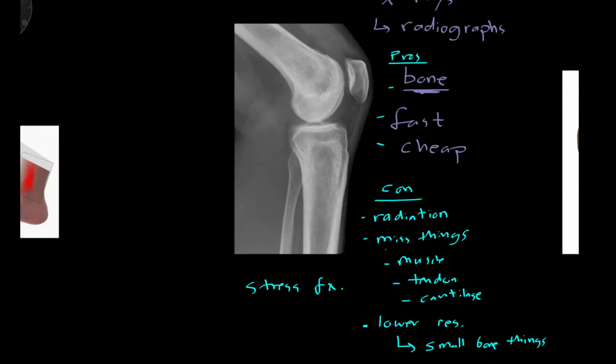So you can have a situation where somebody has a totally healthy looking, say, tibia or fibula on an X-ray, but in truth they have a stress fracture. And the reason you can't see that is because either it's too small or the pathological changes at the tissue level, like swelling inside the bone marrow, just don't show up on an X-ray.